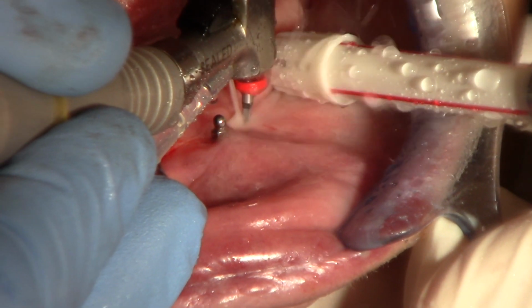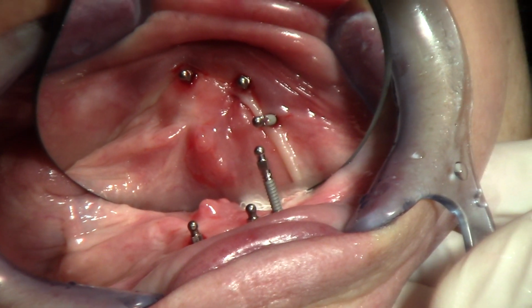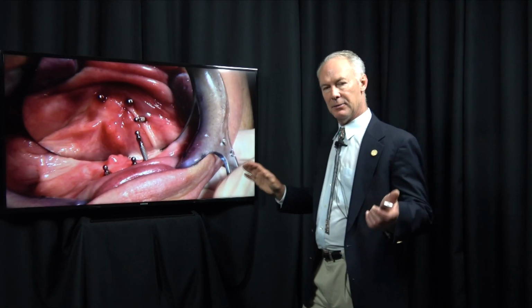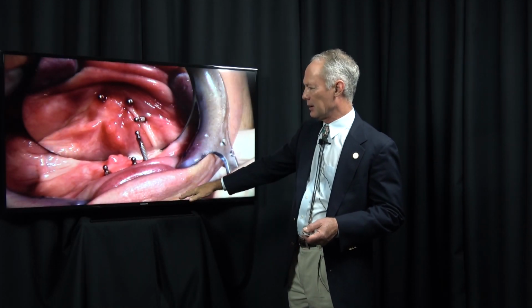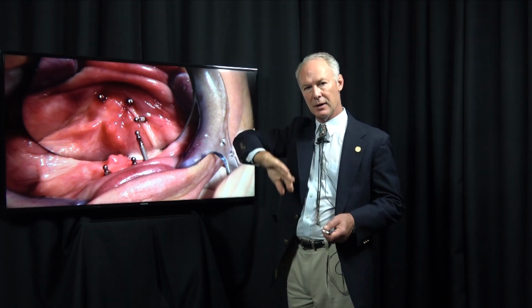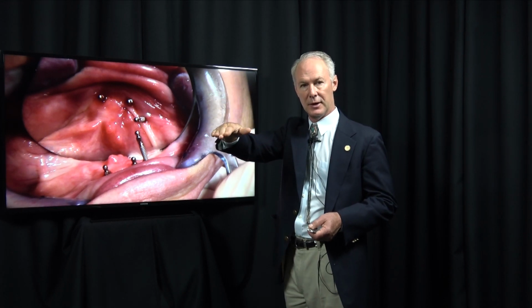So I'm well anterior to the mental nerve. Now something you've got to worry about with the mental nerve is in a patient with a flat ridge. It's sort of like a flounder. If you know what that is, the flounder has both eyes on the same side and it just lays flat on the ocean floor. Well, the same thing happens to the mental nerve if you've lost a lot of bone. That mental nerve will come up to the top of the ridge. The mental foramen could be on top of the ridge, and so if you went back too far distally, you could be drilling right into the mental foramen.